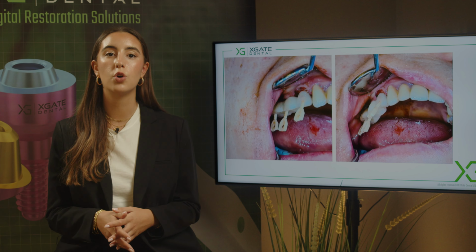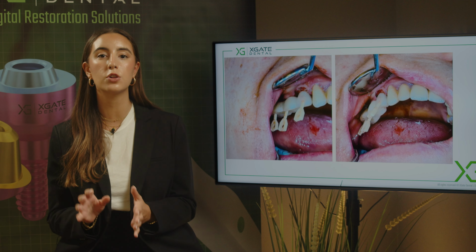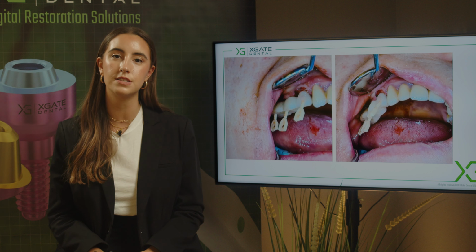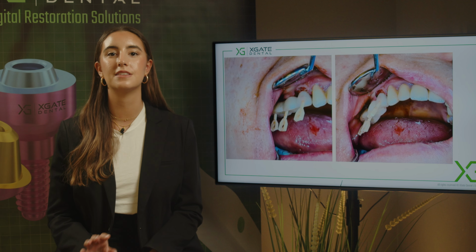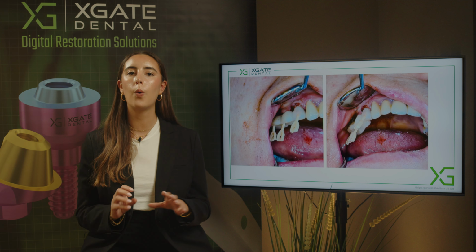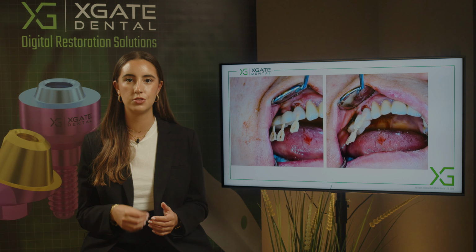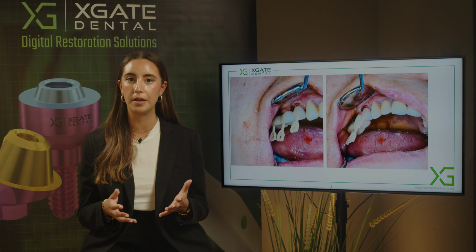In this case, you don't have any teeth opposite to those two molars. You have an occlusion only with tooth number 14. So tooth number 14, you'll want to make a little bit shorter, so you won't have any excess force because it's an implant you just placed. But all in all, you'll know that you're quite safe because you already have two osseointegrated implants. So this bridge will hold and it'll be fine and will be quite strong on those three implants.